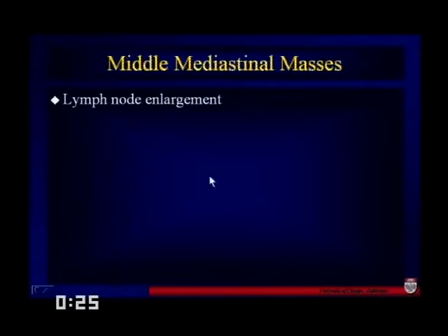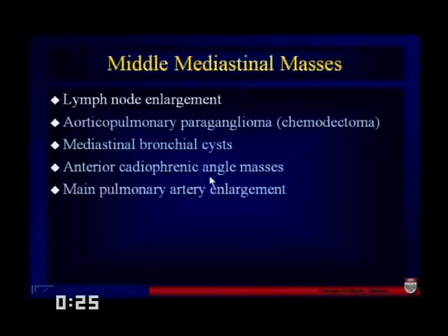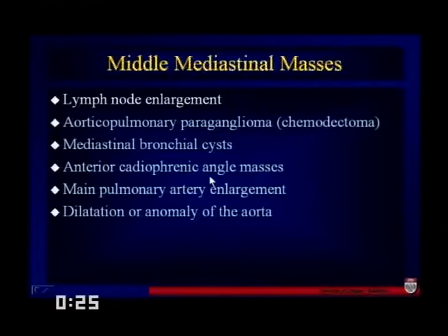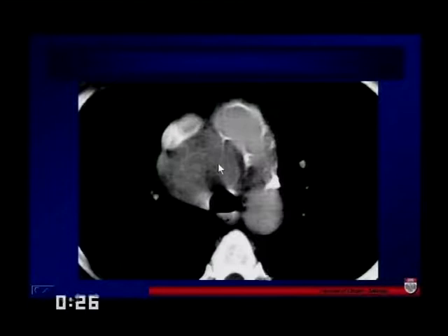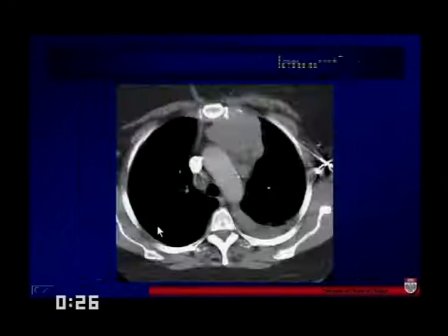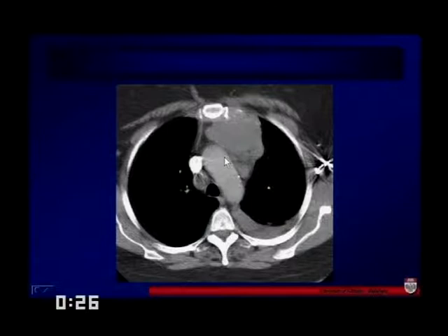Here we can see lobulated adenopathy — a cluster of nodes in the low-right paratracheal region, crossing over into the left paratracheal region, almost into the AP window. This is the most common type of thing we'll see in terms of mediastinal masses. This is another area of significant adenopathy in the prevascular area as well as the right paratracheal region — the most common mediastinal mass we're going to see is adenopathy.